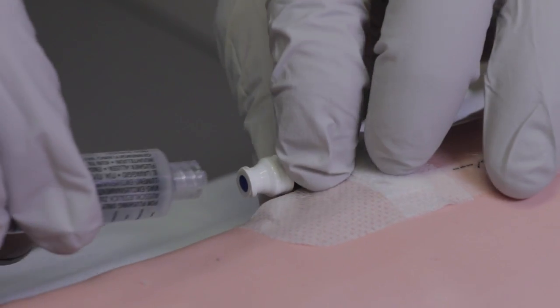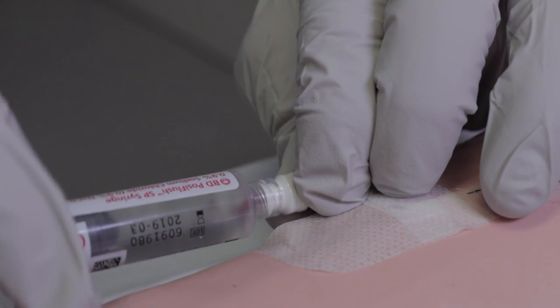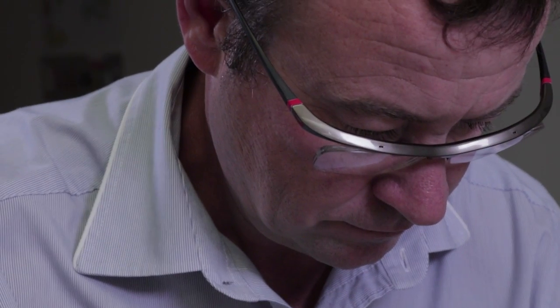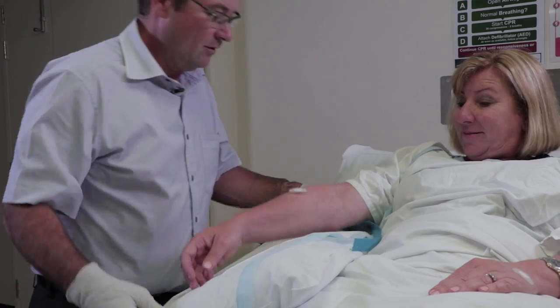This is just some salty water to give it a flush, just so that doesn't clot up. Not hurting at all? No? Feels alright? Yeah, it feels good. Okay. Just making sure I've got the date and time on your dressing so we know when to change it or take it out. There we go, all done. Thank you.